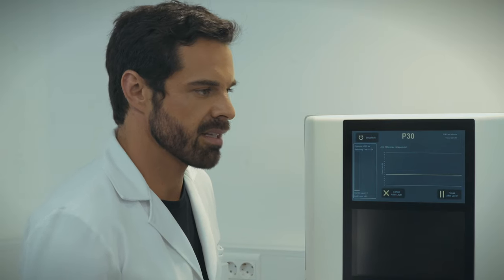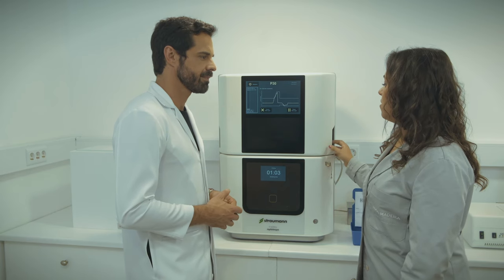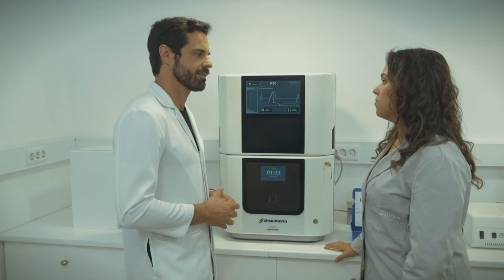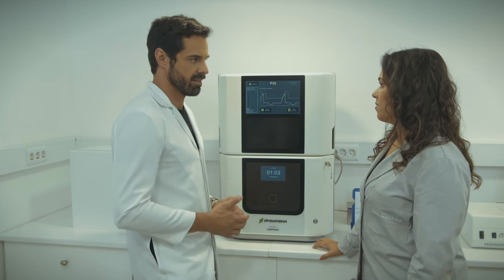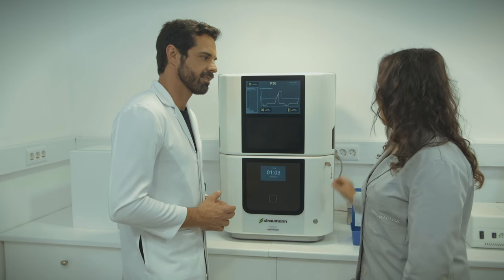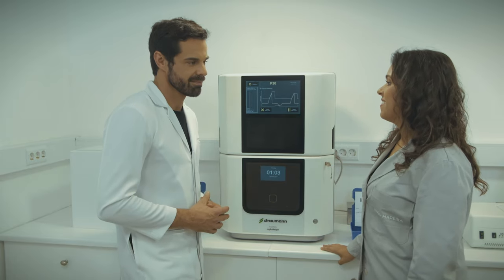Okay. Can you print many models at the same time? And when the time ends, the model is ready to use? No. When the time ends, I take the models and put them in isopropyl alcohol. Okay, to clean? To clean, yeah. Okay. Jessica, this seems very easy. Just insert the pen drive and start to print? Yes, it's very, very easy. I plug it in, I confirm everything and go to do my job. Okay.